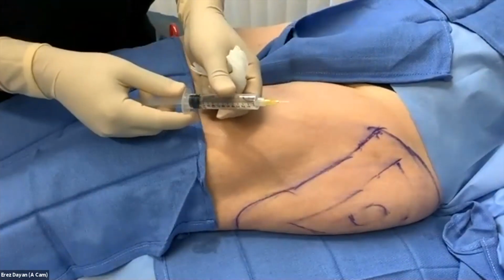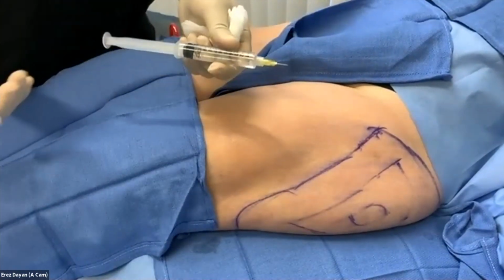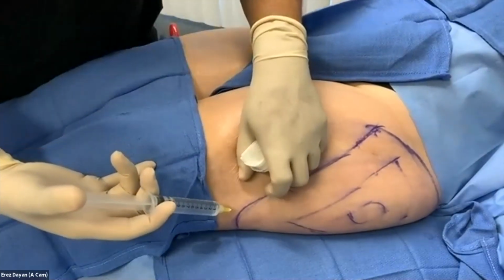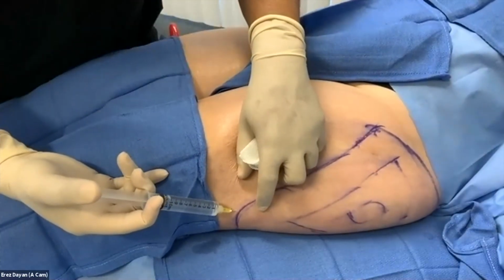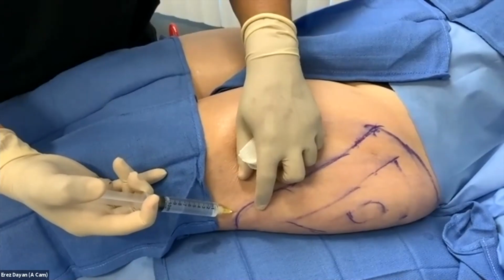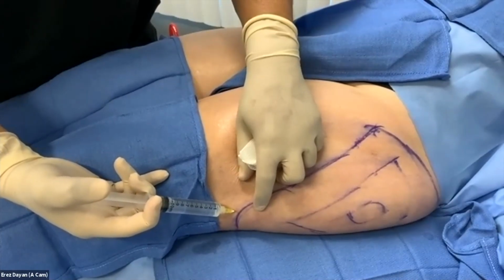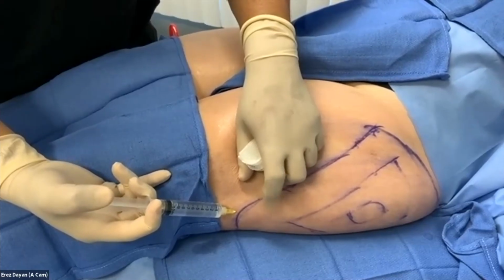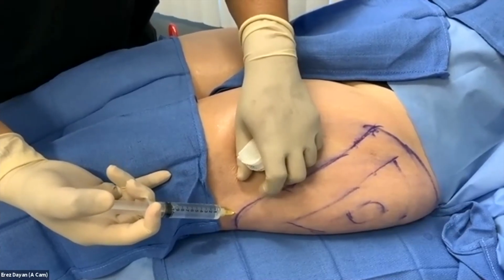So my technique here is pretty simple. I have a 10 cc syringe with 1% lidocaine with epi, just straight, and I'm just going to make my little access port here. And again, she doesn't have any sedation on. This is going to be a straight local case. And I already warned her ahead that if she feels any pain, not to say anything. So hopefully that'll be the case.